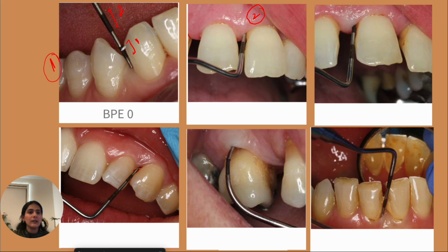Can you see the first one? We can't see the first one here. We can only see the second marking here. That means it has gone beyond a point. It has crossed this point and it should be 4. Kudos to all of you who have answered 4. That means it's clear to you.